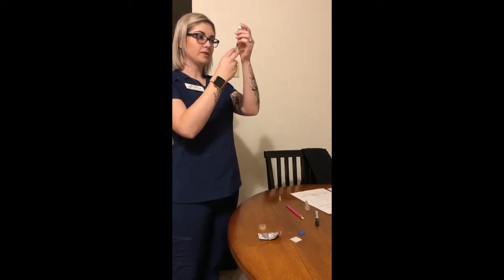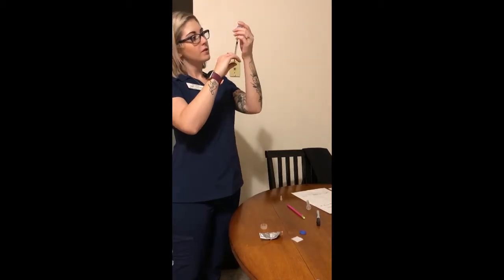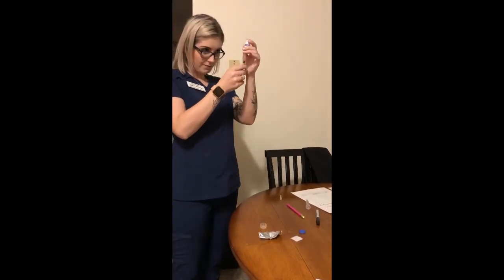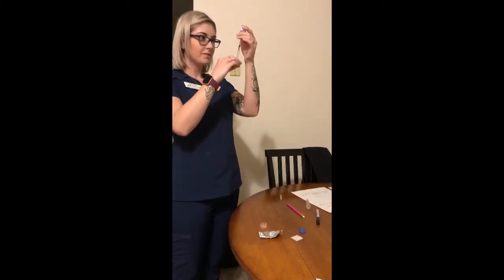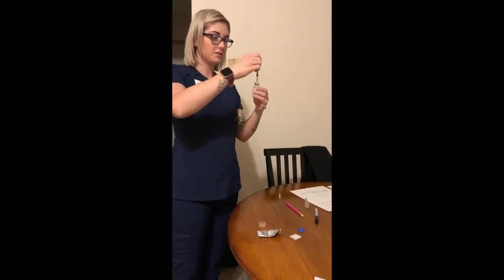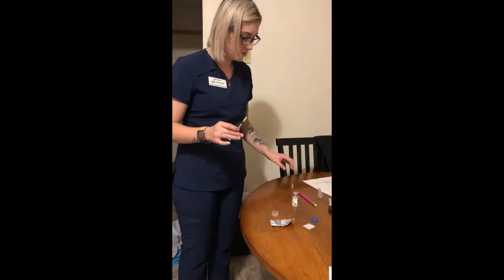You can tap it if there's an air bubble. Then you want to invert it, set it down, pull your needle out, 0.1.